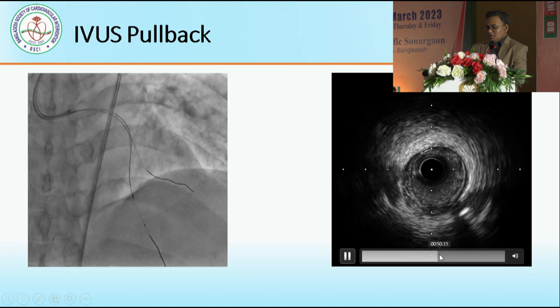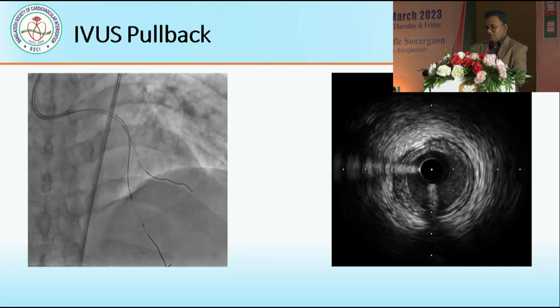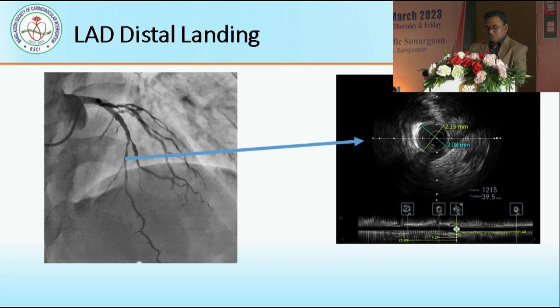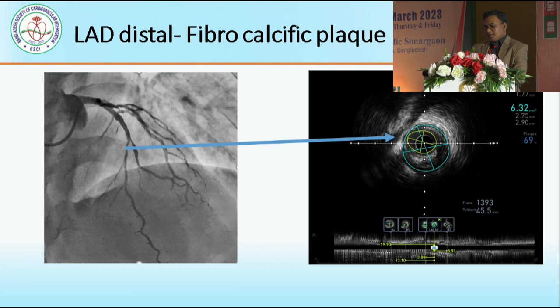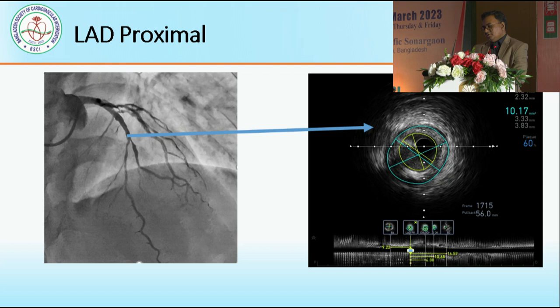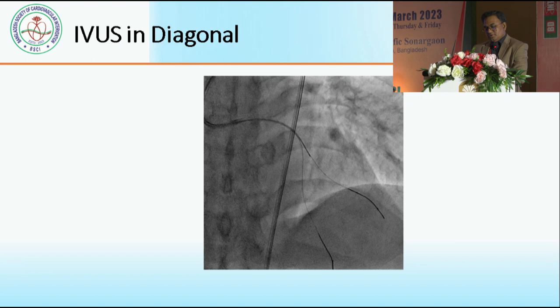We can appreciate that there is a fibro-calcific lesion, and here is the origin of diagonal 2 — we can see the two wires. If we consider the LAD distal landing, there is a 2.1 mm diameter distally, and the LAD proximal landing is 3.9 mm by IVUS. The LAD distal fibro-calcific plaque has a very low minimal luminal area and 69% lesion burden. The LAD proximal also has 60% plaque burden.